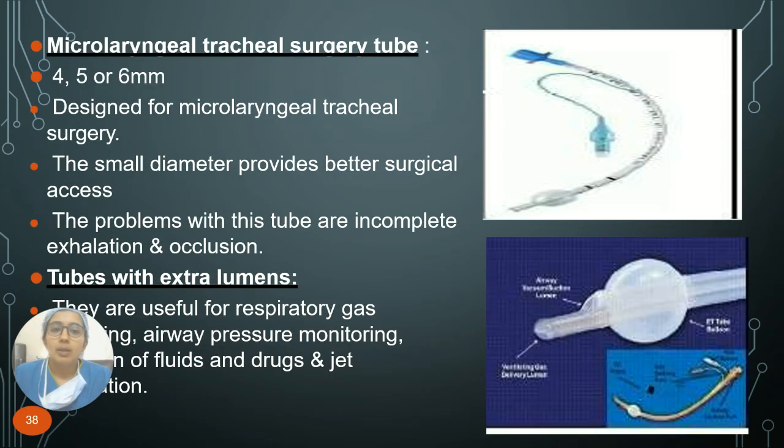Then we have microlaryngeal tubes designed for microlaryngeal tracheal surgeries. They have small diameters and longer lengths.